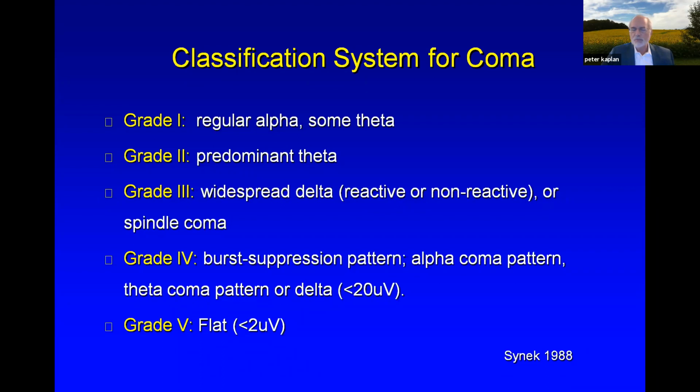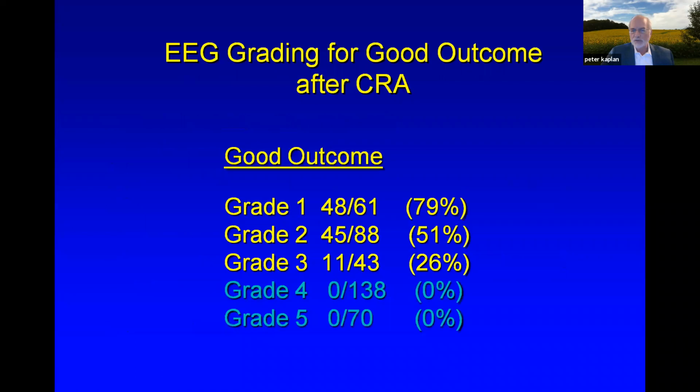Because anoxia often produces irreversible change, whereas almost all other etiologies, let's say, and typically you look at anesthesia, these are all reversible. So you can go all the way down to flatline, but be totally reversible. So largely, the prognosis depends on the irreversibility of the insult and therefore the etiology. So it was important to be able to predict what happened when people were anoxic.